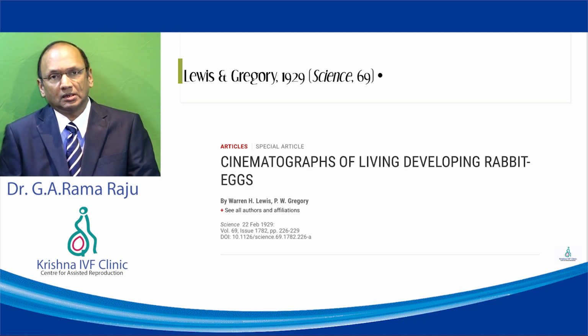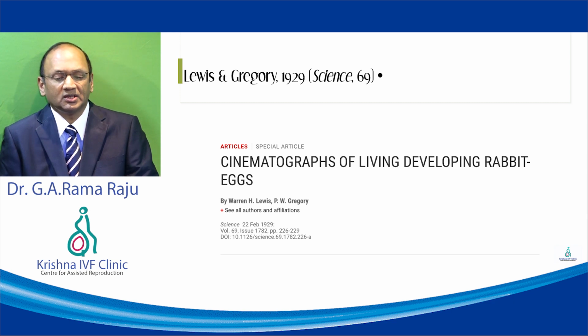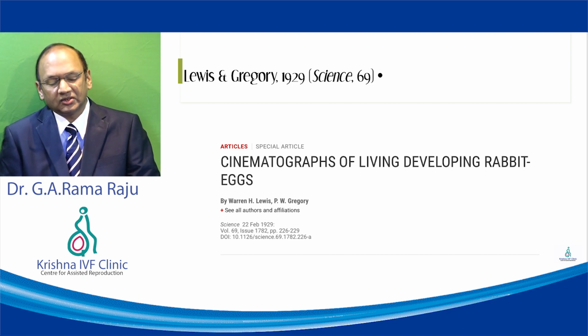We think technology is a word we use for new things, but it is almost 90 years since the first publication on time-lapse technology. It was applied by Lewis and Gregory on rabbit eggs, and published in the Science Journal in 1929. It is only with the advent of improving technology, computing sciences, data storage, and the miniaturization of the equipment that time-lapse technology has become what it is today.